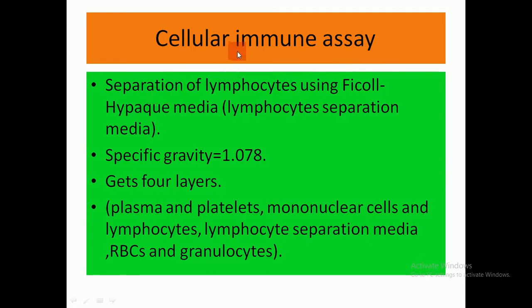To do the cellular immunity and to detect the cellular status of the immune system, first we must separate the lymphocytes. And here we use the media called lymphocyte separation media, or the Ficoll Isopaque media.